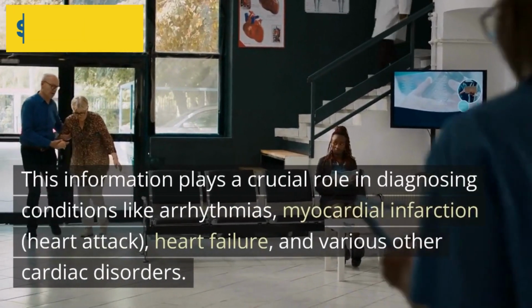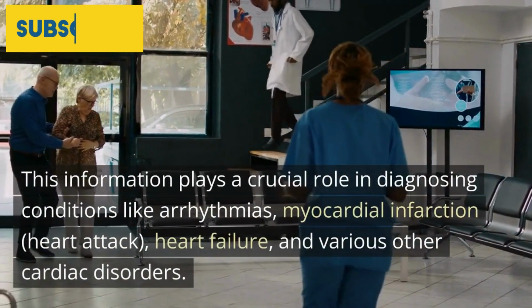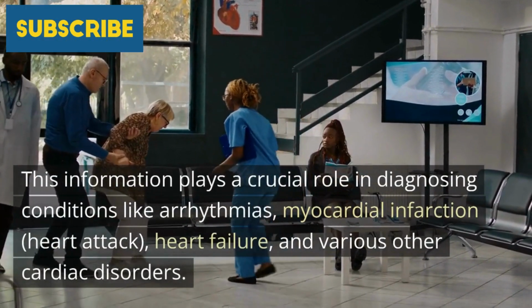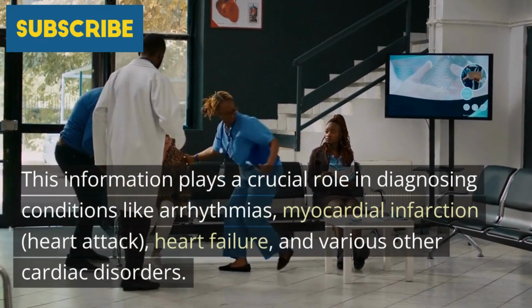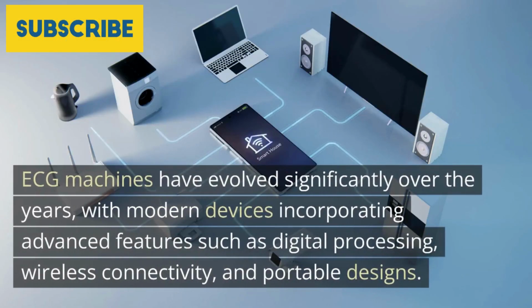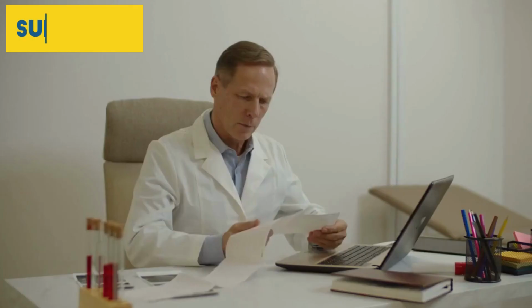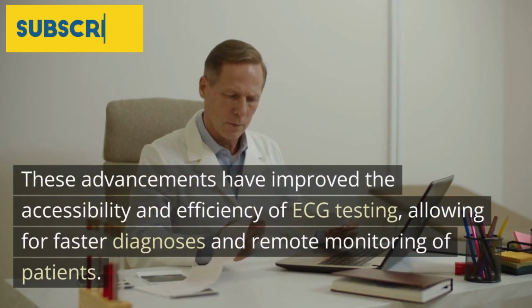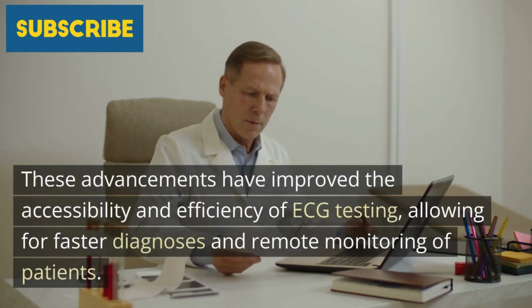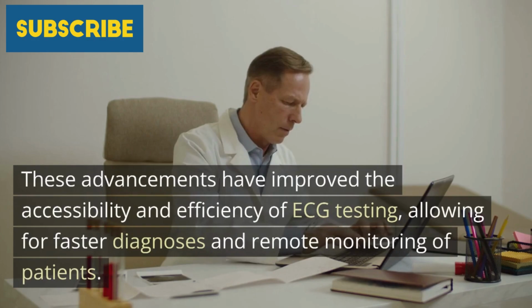This information plays a crucial role in diagnosing conditions like arrhythmias, myocardial infarction, heart attack, heart failure, and various other cardiac disorders. ECG machines have evolved significantly over the years, with modern devices incorporating advanced features such as digital processing, wireless connectivity, and portable designs. These advancements have improved the accessibility and efficiency of ECG testing, allowing for faster diagnoses and remote monitoring of patients.